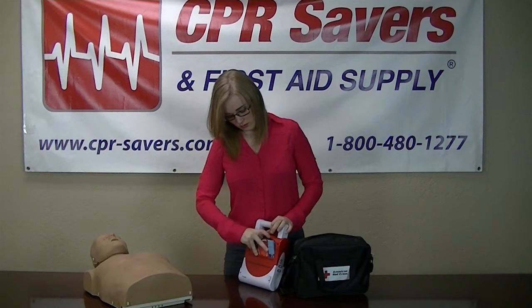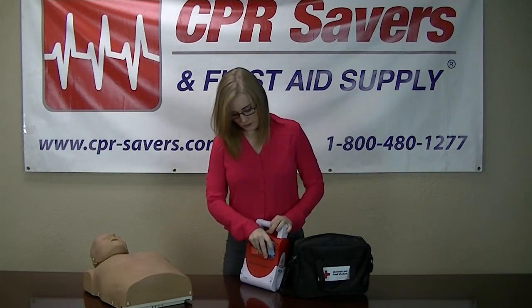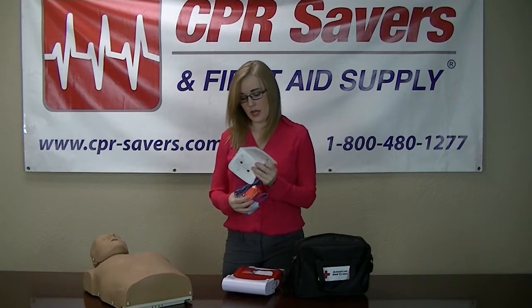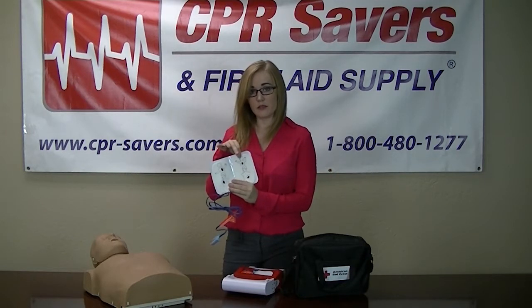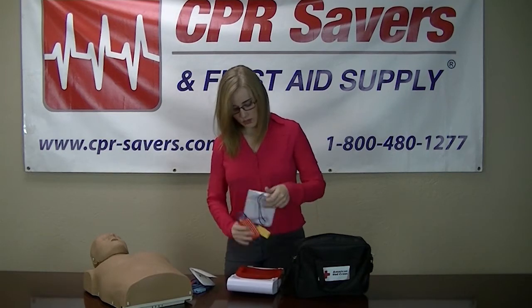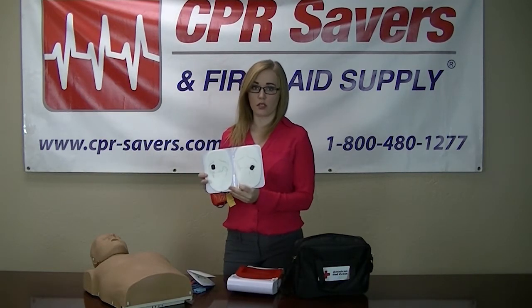Your pads are stored in the back of each unit. You're going to have one set of infant pads. On the pads, it's going to show you placement, as well as on the adult pads. The adult pads are going to be quite larger.